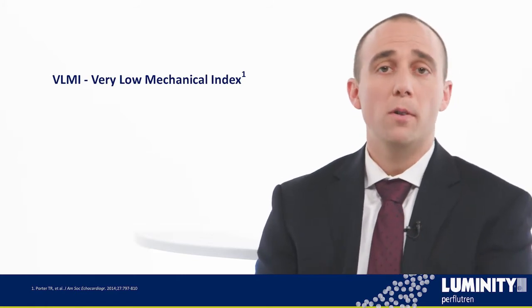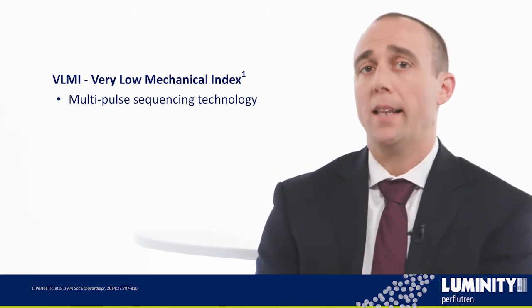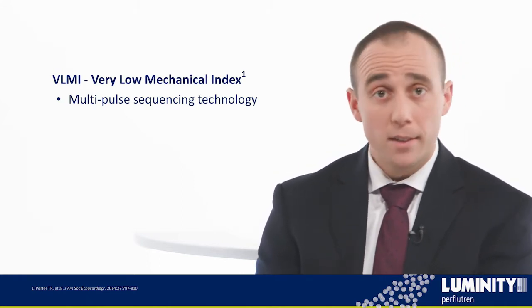So I want to take a moment to discuss very low MI. You may have heard about using very low mechanical index imaging. VLMI, or very low mechanical index, is a technique that uses multi-pulse sequencing technology. Now, that's important because there have been many misconceptions that very low mechanical index is basically just lowering the MI less than 0.2. And that's not true.